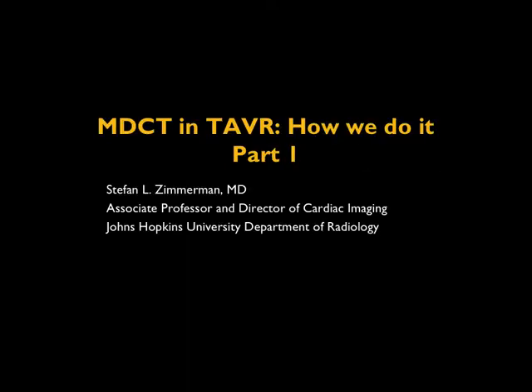Hello, my name is Stefan Zimmerman. I work with Dr. Fishman here at Hopkins. I'm an associate professor here and do a lot of cardiac imaging. And today we're going to talk about the use of CT in TAVR.